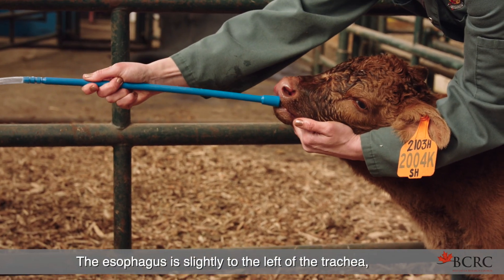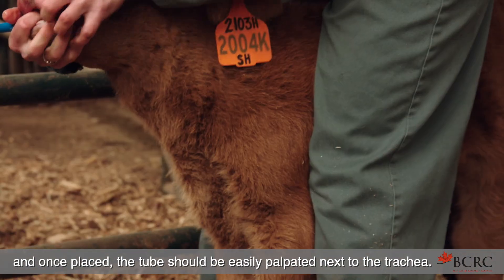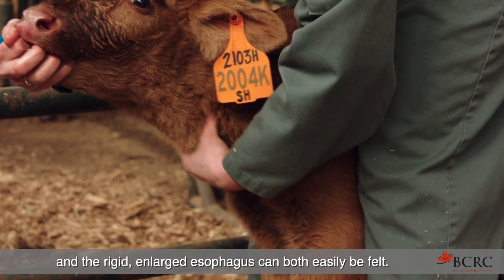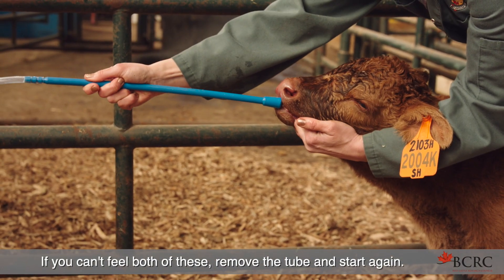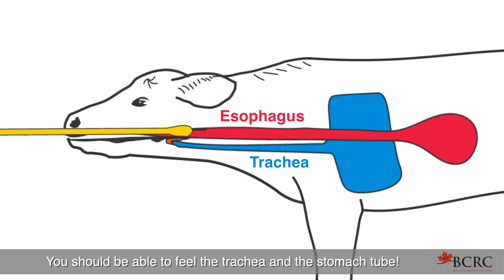The esophagus is slightly to the left of the trachea, and once placed, the tube should be easily palpated next to the trachea. If properly positioned, the rings of the trachea or windpipe and the rigid enlarged esophagus can both easily be felt. If you can't feel both of these, remove the tube and start again. Remember the two tube rule: you should be able to feel the trachea and the stomach tube.